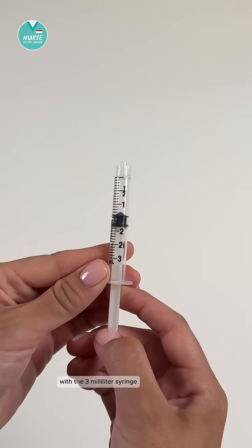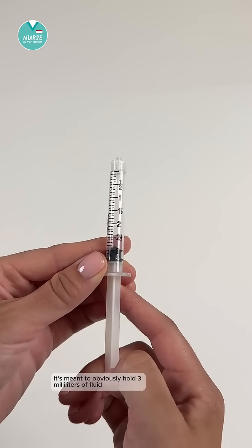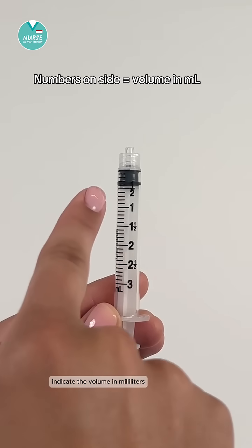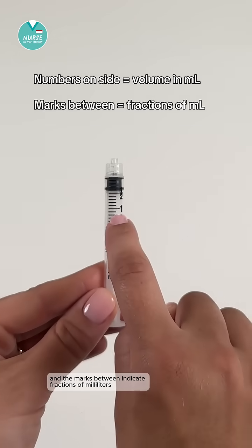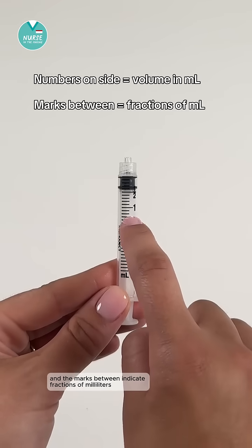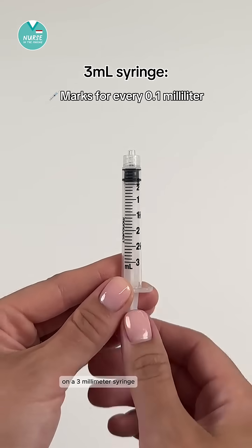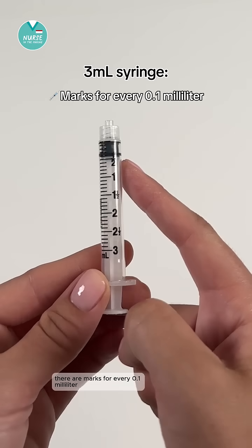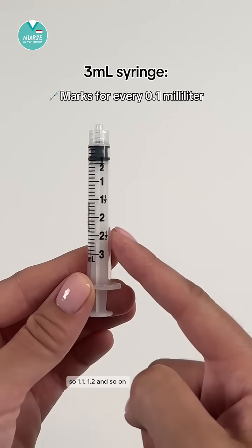With the three milliliter syringe, it's meant to hold three milliliters of fluid, so the numbers on the side indicate the volume in milliliters and the marks between indicate fractions of milliliters. On a three milliliter syringe there are marks for every 0.1 milliliter — so 1.1, 1.2, and so on.